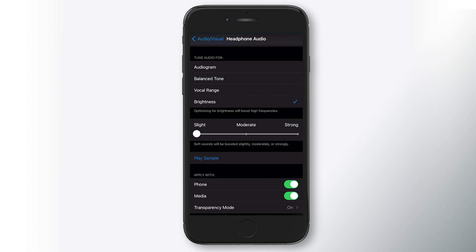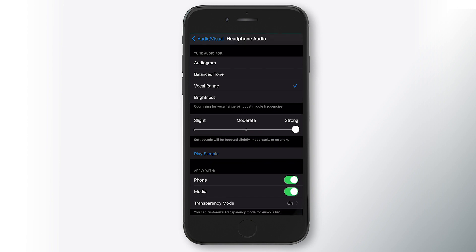There's a key difference between these two things. Slight, moderate and strong is talking about applying the sound, applying the boost or adjusting the tones of everything: phone, media, transparency mode. If you go in here and select moderate, it sounds a little bit more like my audiogram settings. If I go in and select strong, that's very close to what my audiogram actually is. What this does is it's a normal bright boost. It's what you get from a lot of over-the-counter hearing amplifiers. It's just a standard bright boost. You can also boost the vocal range. This may be good if you're in conversations. And again, this is if you don't have the option of using your audiogram. Audiogram is always going to be superior. So just keep that in mind.